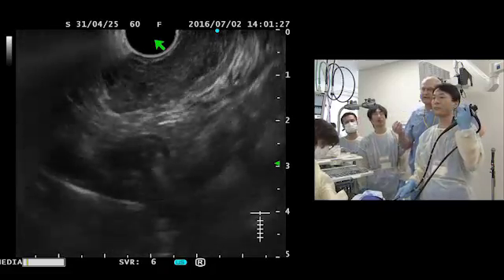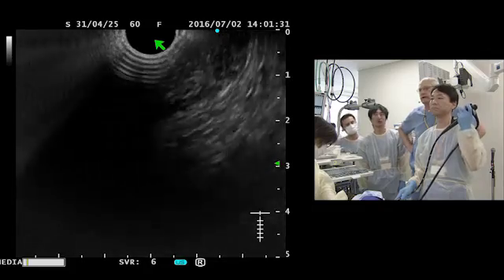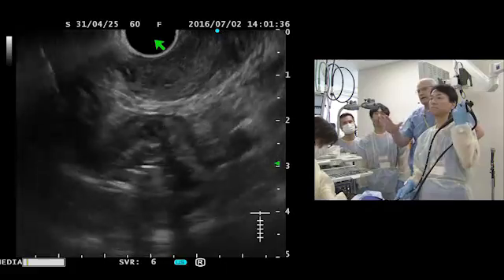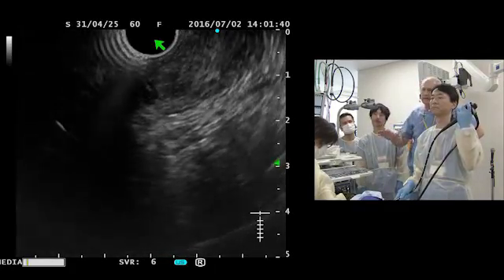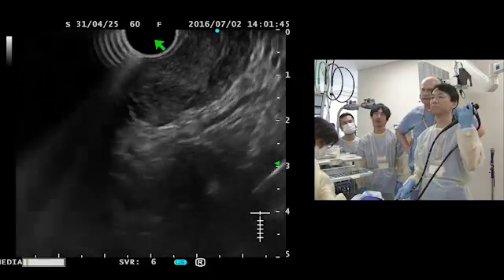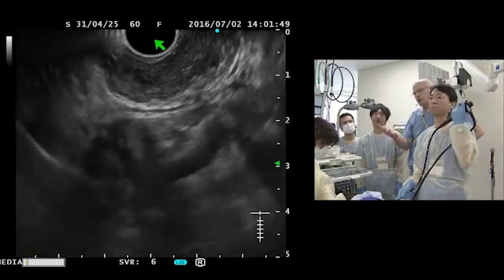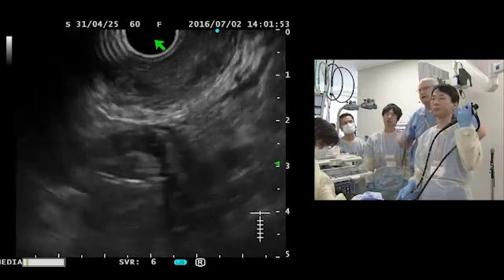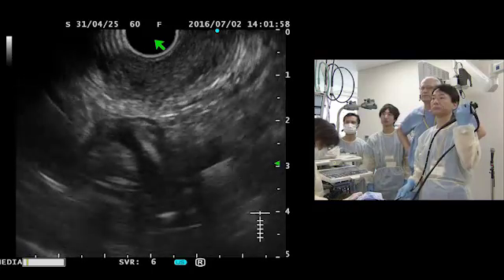I think if it is a GIST, it has some worrisome features to it, Philip. Again, the irregularity and the inhomogeneity make us wonder about the exact nature, but it is not typical. As you know, stromal tumors in the stomach are usually GISTs, not leiomyomas, but this one looks to me to be more worrisome.